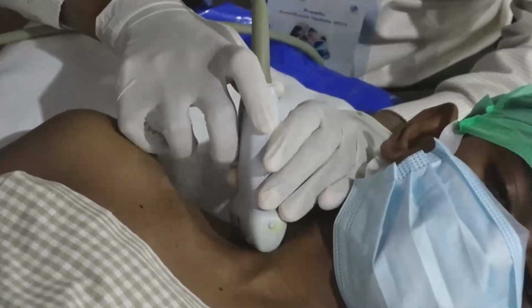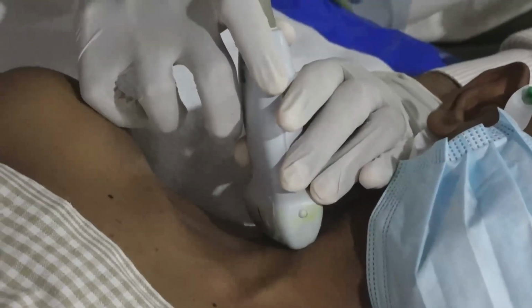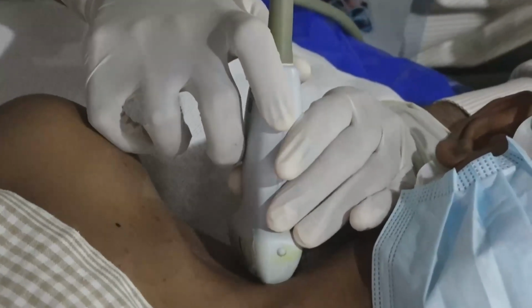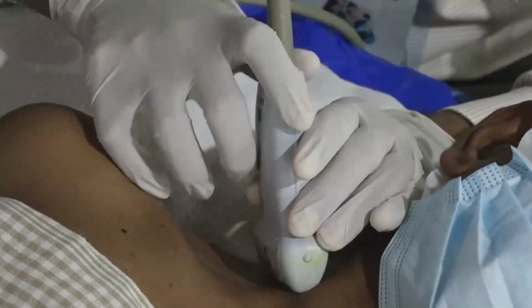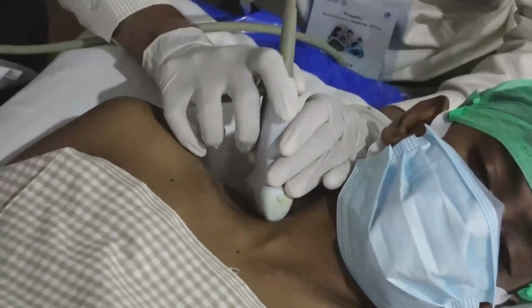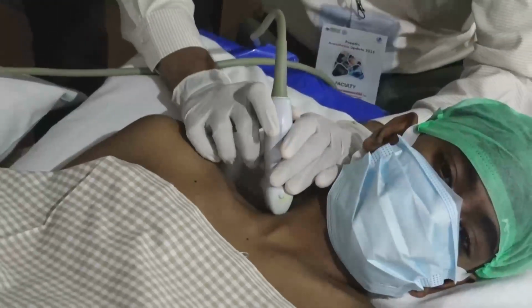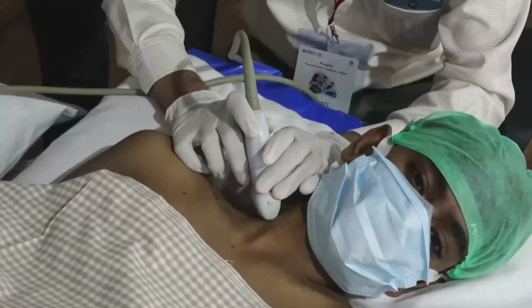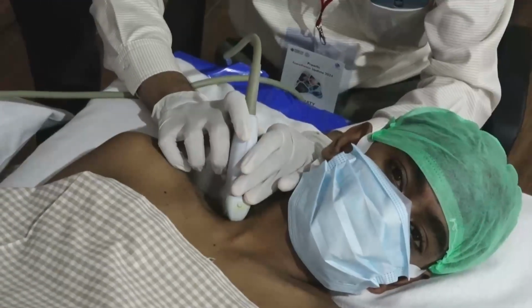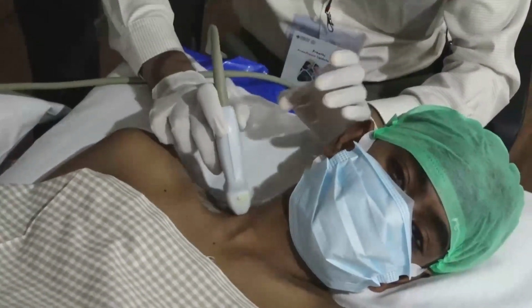And there is a lot of gap, or sometimes depending on the place, there is a gap between the C5 and C6. So one, we identified C5 is a little away, and it is single, and now we have to identify the trunk.